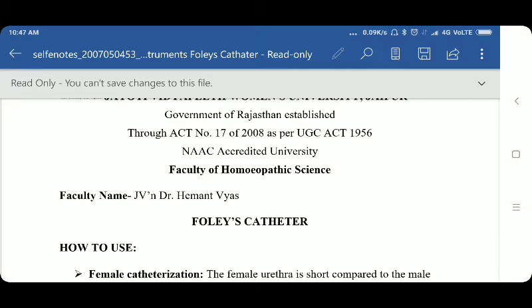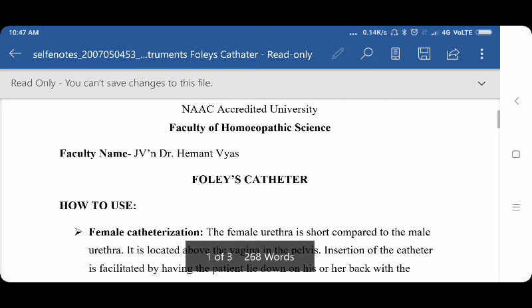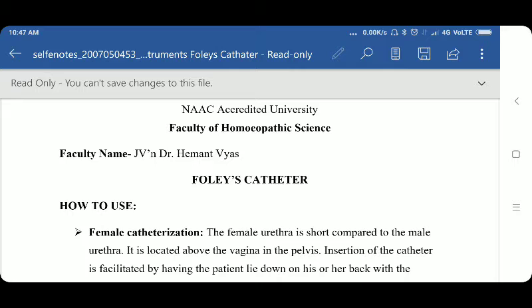In today's session, we are going to discuss an important topic from Surgery Practical and the name of the topic is Foley catheter. Today we are going to discuss how to use the Foley catheter, what are the parts, what are the types, what is the standard procedure to use, and what are the uses of the Foley catheter. The full name is Foley indwelling catheter — we can put this catheter inside and do not have to hold it all the time. It is an indwelling and self-retaining catheter; it will stay in position for approximately 5 to 7 days easily.